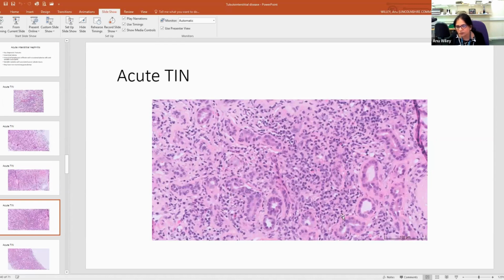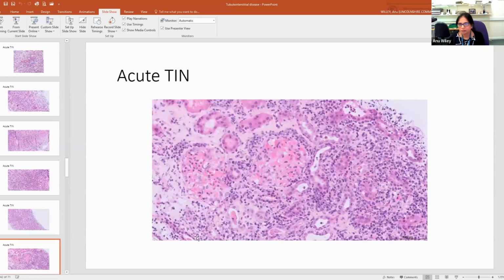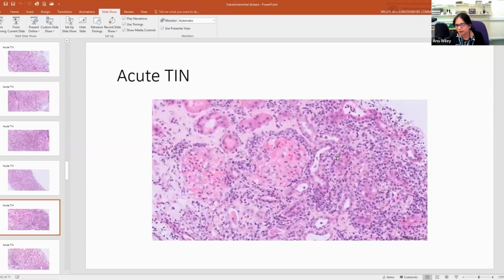Here it's very difficult, but you can see that there is a big tubule there which has been completely taken over, and there's another one here, and another one here. So you will see them scattered, and still a few eosinophils sticking around. Another one, I'm going to just go ahead, because that's another tubule there showing it. And there's a lot again of eosinophils and some tubulitis there.